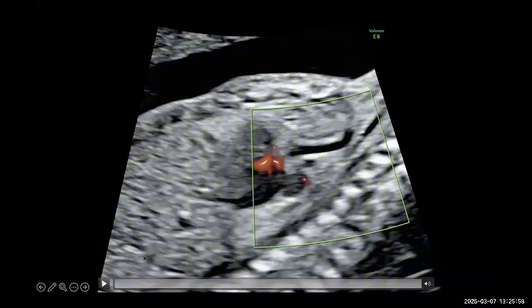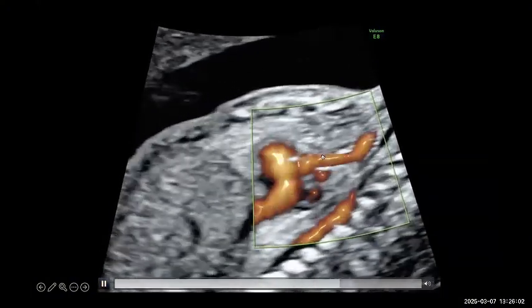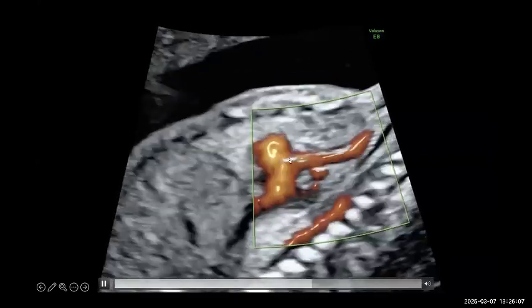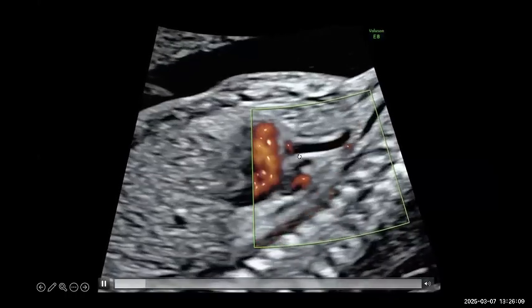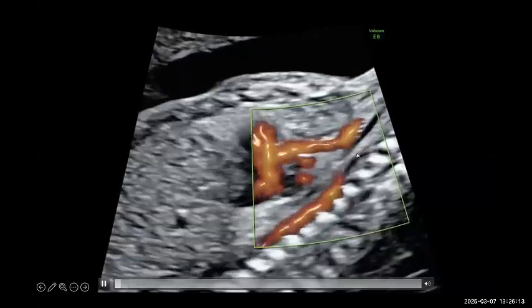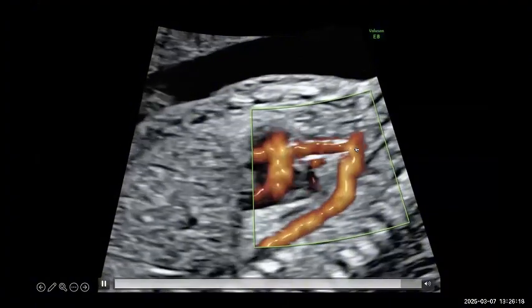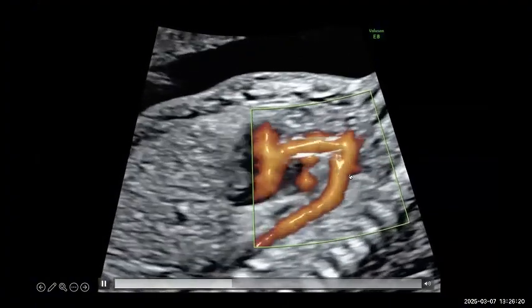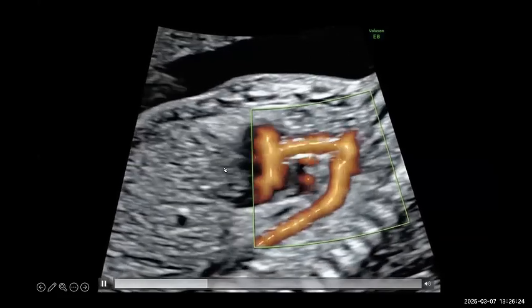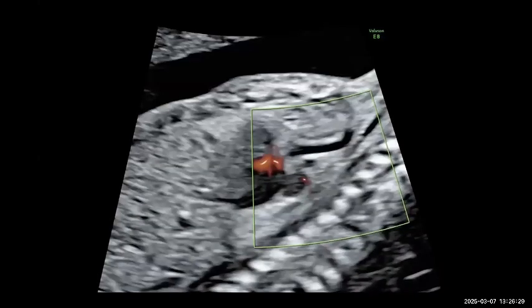This is a recent patient of mine that I put here because I think it's very clear that the aortic arch is very abnormal. This is with power Doppler because I wanted to highlight how tortuous and hypoplastic the ascending aorta is. It's a sort of angulated, Gothic arch. I think there is some flow persisting that starts after the first branch, a very clear posterior shelf, and diffuse arch hypoplasia. This baby also has a bilateral superior vena cava with a left SVC to the coronary sinus.